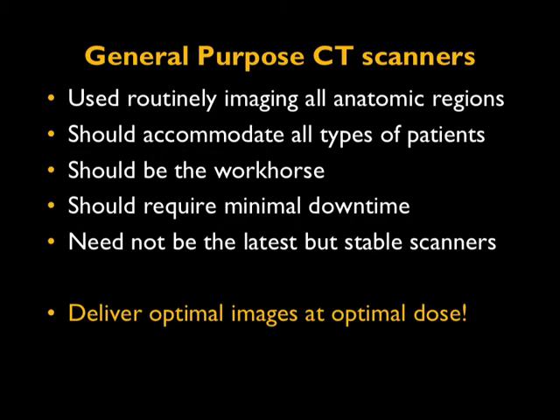A general purpose CT scanner can be thought of as one used routinely for imaging all anatomic regions. It should become the bread and butter of that particular department. Any type of imaging can be done on this scanner.